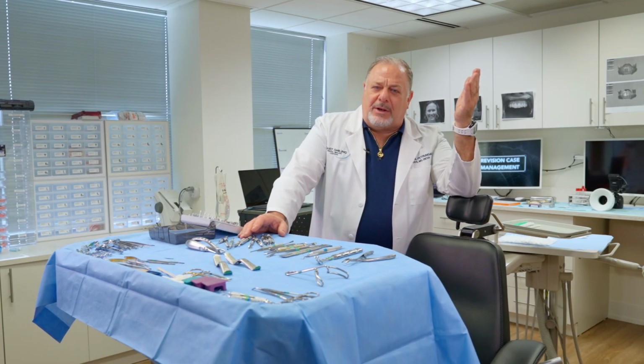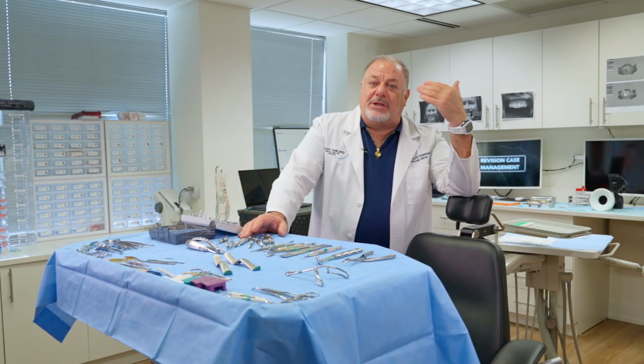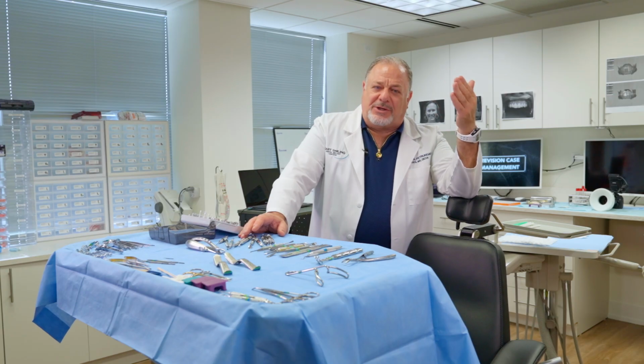Then they meet with, again, Nicole, our head staff person. She goes through the size of the teeth that we're going to replace, shade, the color, shape, and then what we're planning to do with the tissue. And then, of course, that goes back to our digital designer.